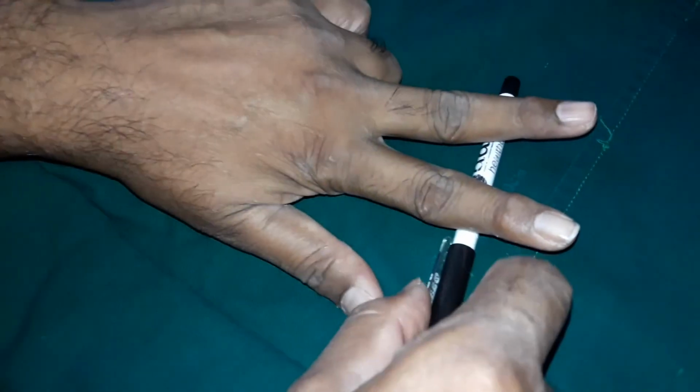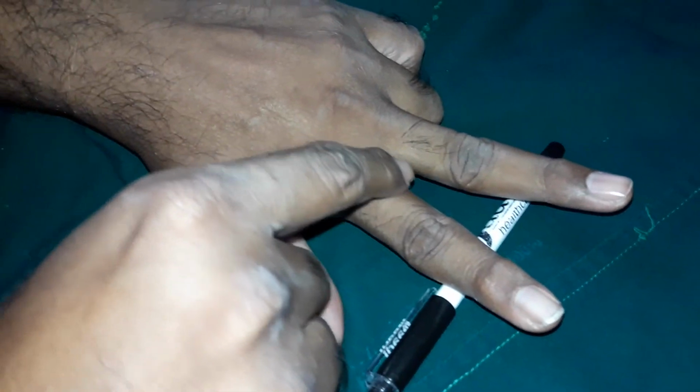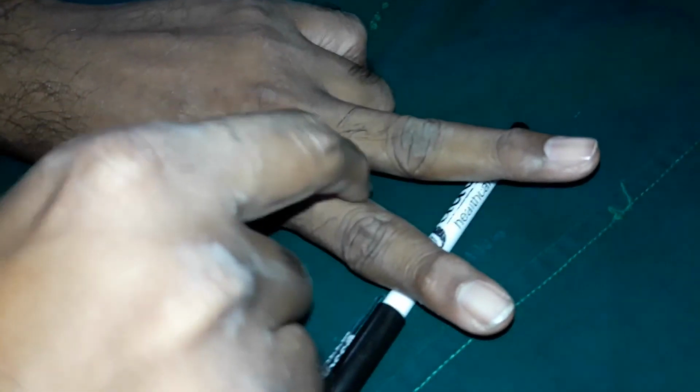In grade 4 and grade 3 round windows, you need to drill the bone anterior to this facial nerve and inferior to this facial nerve. Then there is a potential chance of injuring this facial nerve. So when you are drilling the bone anterior and inferior to the facial nerve, you have to be very careful here. Thank you.